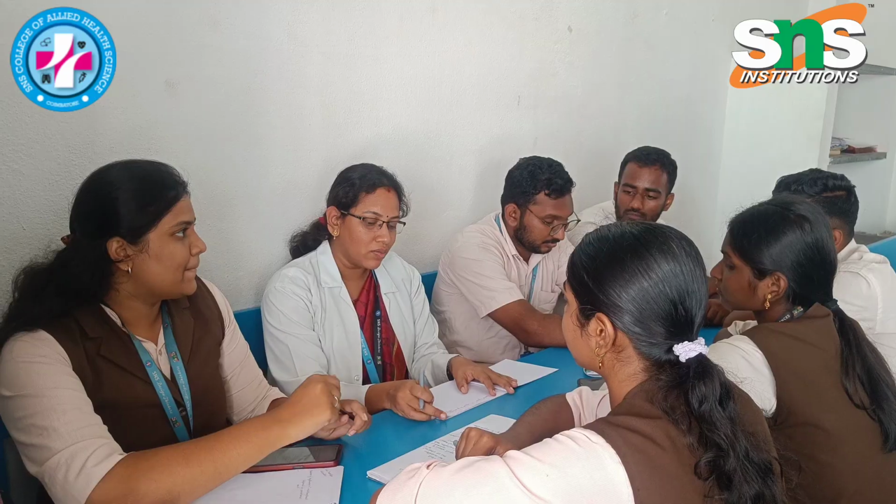Okay. So why not go for chamber surgeries with partial bypass? Because opening of a chamber will have a high risk of air embolism. That is the reason we are not going for a partial bypass. The main risk of going partial bypass is that sometimes you don't get proper drainage from the patient. Why? Because of the beating of the heart.